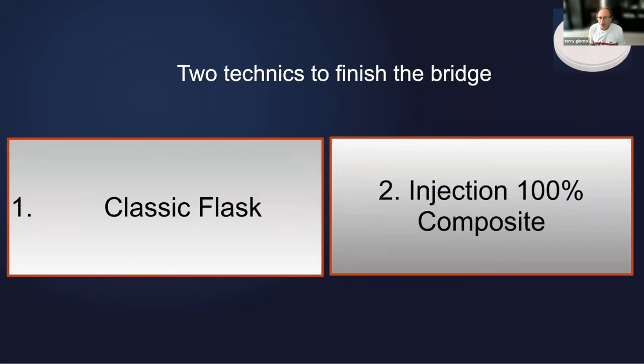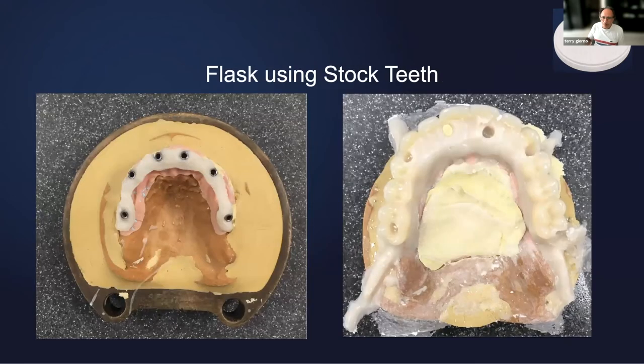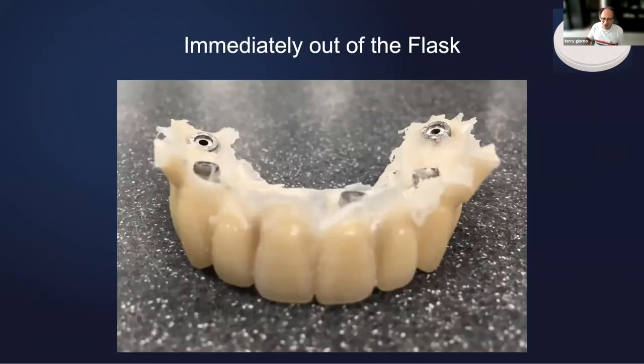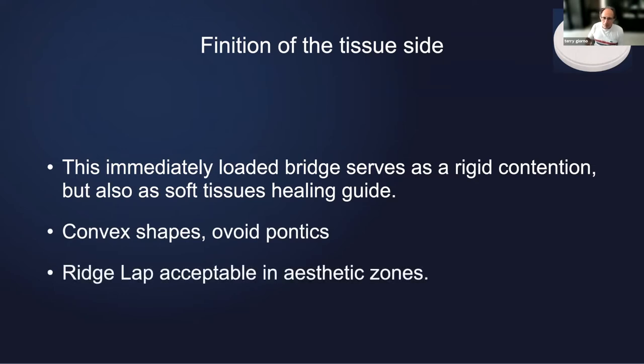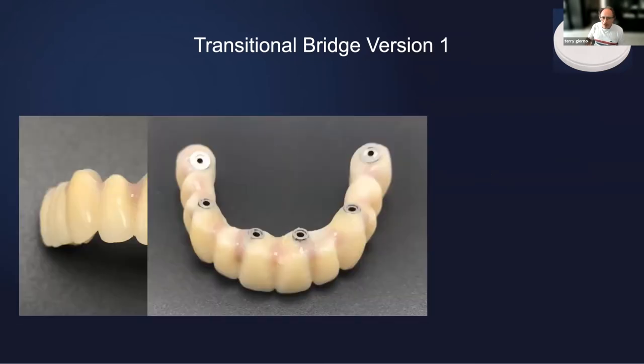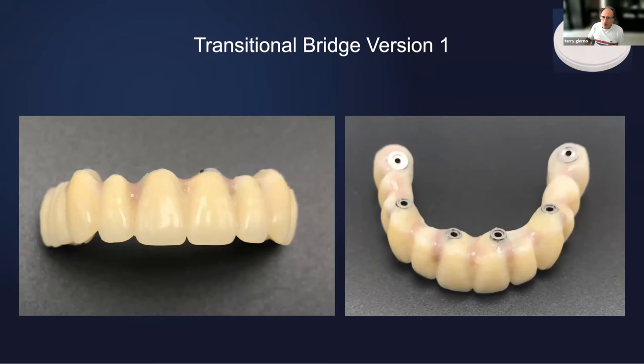Now, two techniques to place the teeth: either you use the flask — the conventional technique — or you can inject composite into your silicone jig. Let's go for the flask. Nothing exotic, very simple. You deflask, you remove the flashes, you polish. You make everything convex because this is for immediate load — it's the day of the surgery, basically. Convex shape, ovoid pontics — you can do ridge lap. And this is after a couple of hours: the temporary bridge.